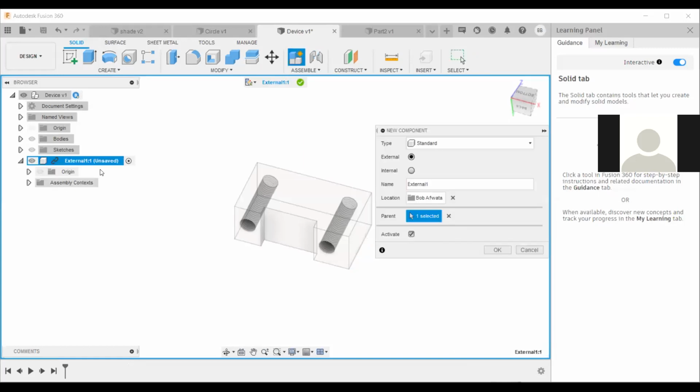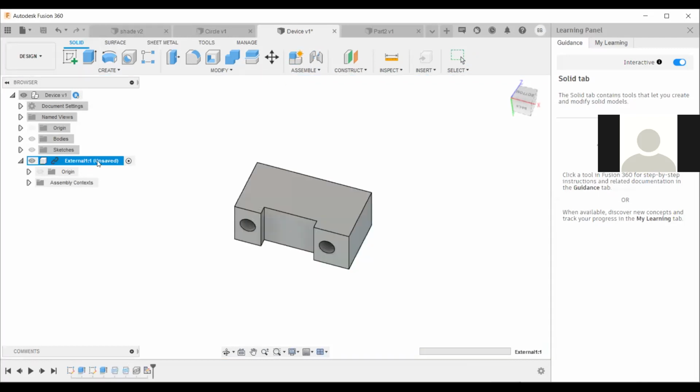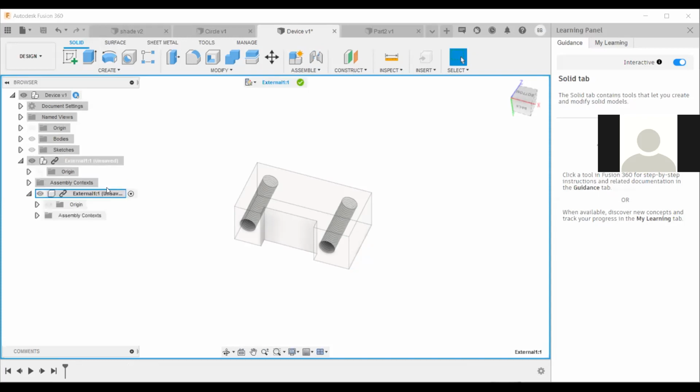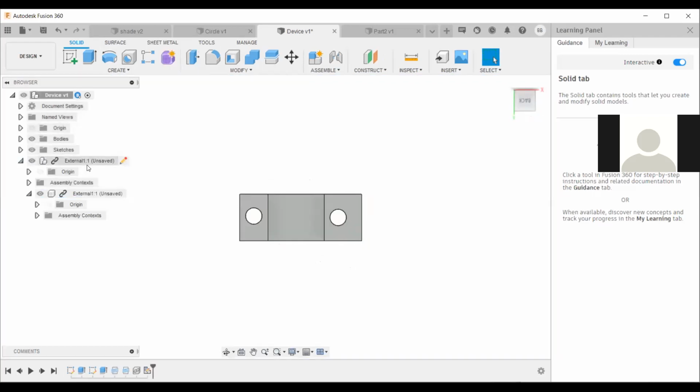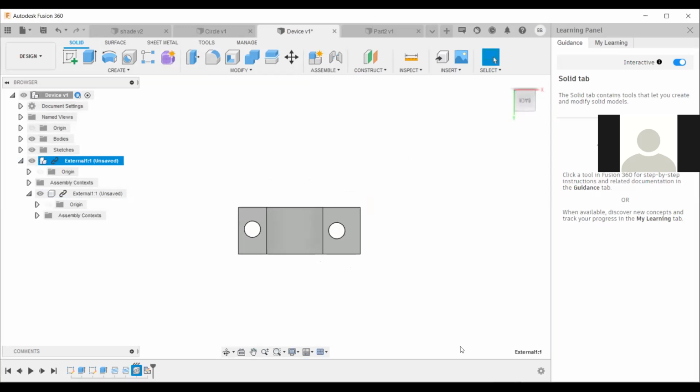Okay, so it's creating a new. Okay. Sorry, guys. Fusion is slightly different from SolidWorks, so it requires you to create a new design. We will review this tomorrow. But just where you have reached, we will bring them together. But you can just practice, create two parts, and we will see. This one, apparently, that is how you have to start it and bring them together.